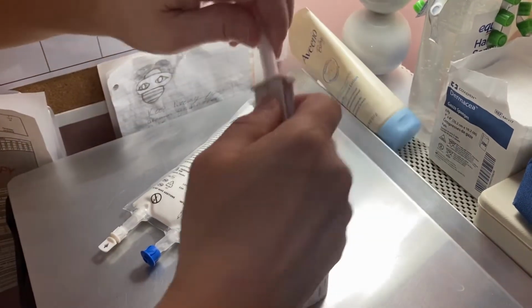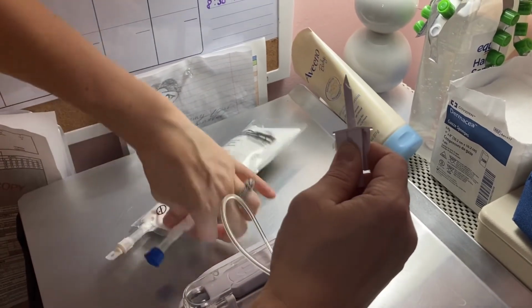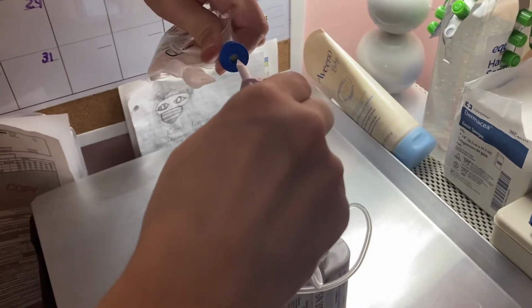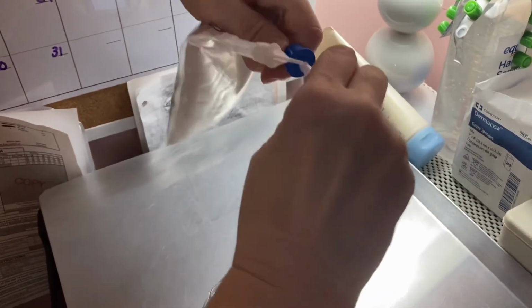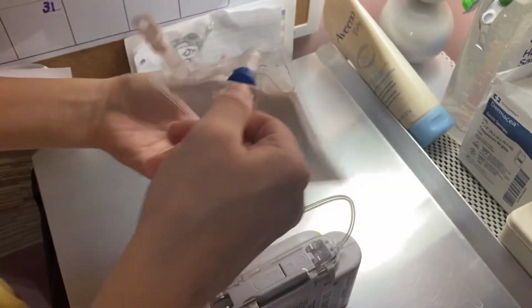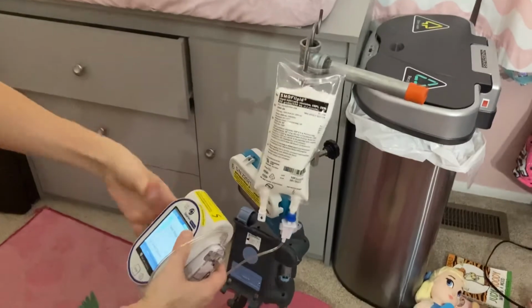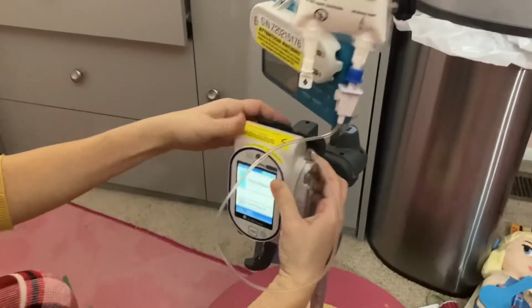When you remove the cap from the tube spike, it will already be sterile and will not need to be scrubbed. Making sure neither surface touches anything, insert the spike in the blue hole. You have now spiked the bag. Next, you're going to get ready to prime the lipids through the tubing, so you'll hang it on the pole.